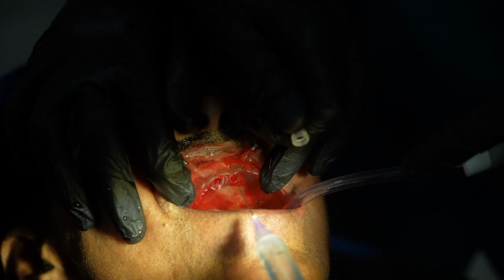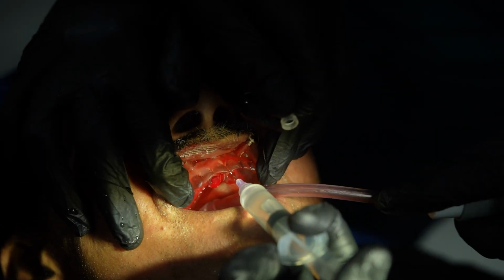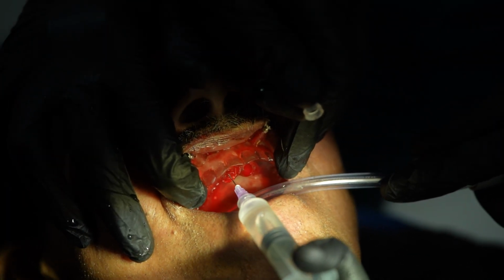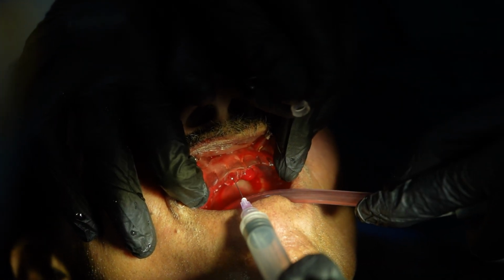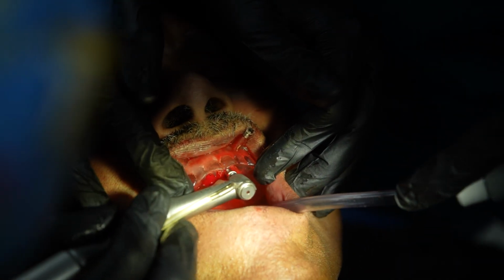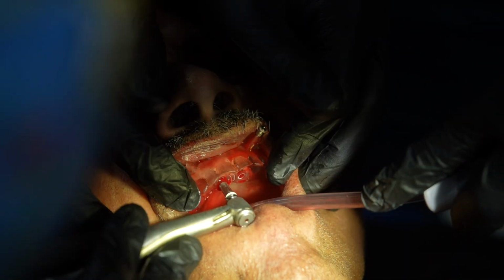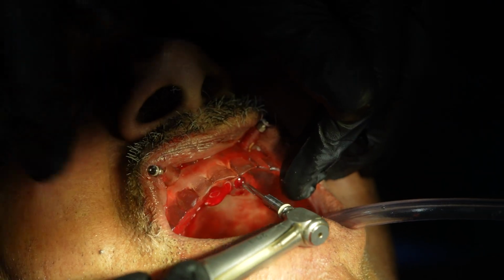Between the drills you are supposed to use the saline syringe and keep using it within your osteotomy site. What will help is the bone debris or the bone fragments won't accumulate at the bottom, because if they accumulate, then your osteotomy won't go till the depth. This is 2 by 11.5. This is 2 by 13.